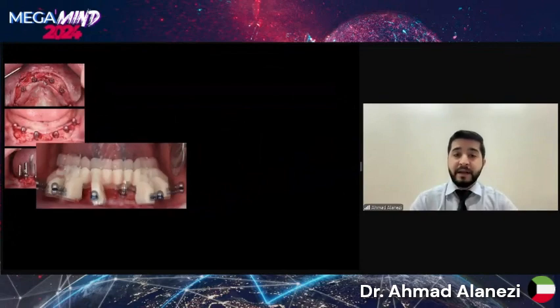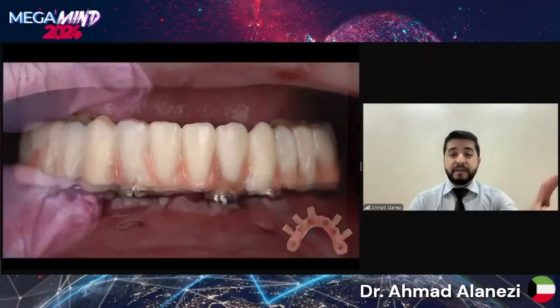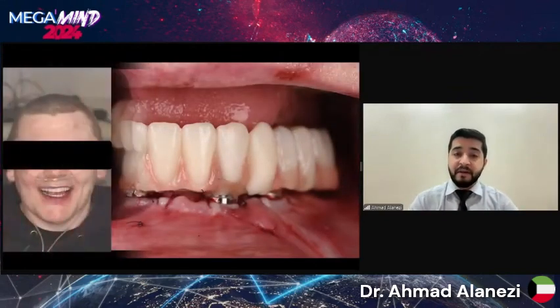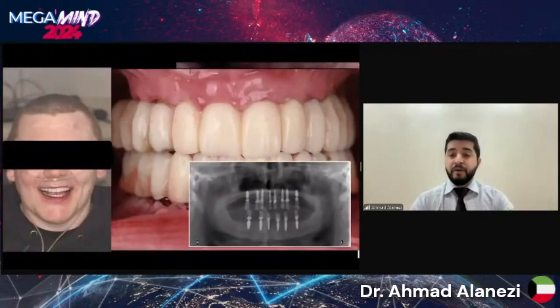Our prostheses were placed and picked up. As you can see, they are exiting from our predetermined channels. Then this is our prosthetic, and this is how the patient has his prosthesis on the same day of the surgery. And this is the post-op OPG.